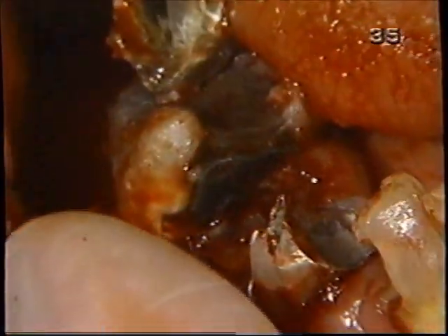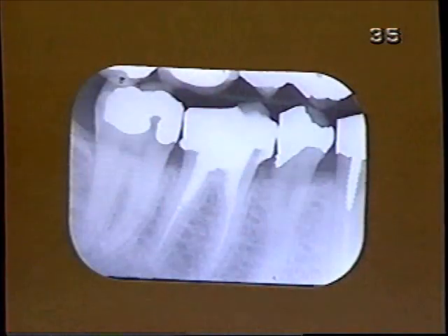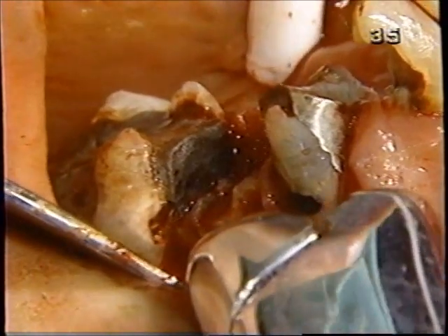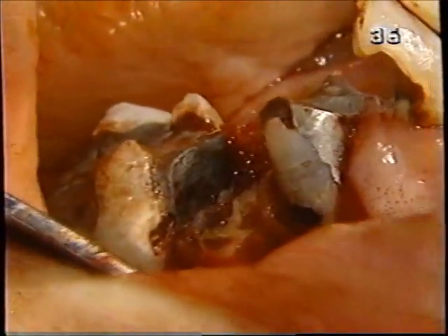Well, even though it broke, it's luxated, and I'm glad now that we made that release where we did. If we hadn't, then we'd have a mess with multiple releasing incisions. Now we have a root that's fractured off at actually below the bone level on the lingual side, and a little coronal to the bone level on the buccal side. We've changed from a 151 to a 151S because we can see better, we can have more control.